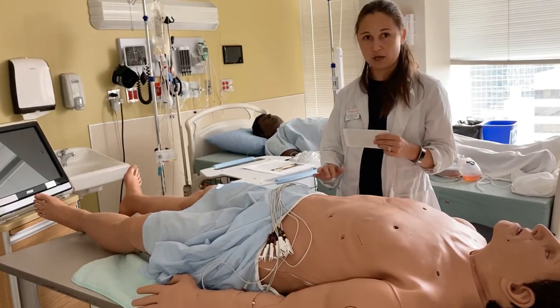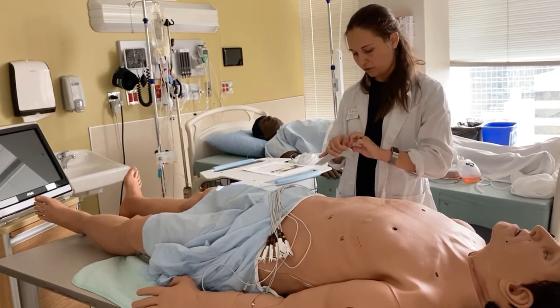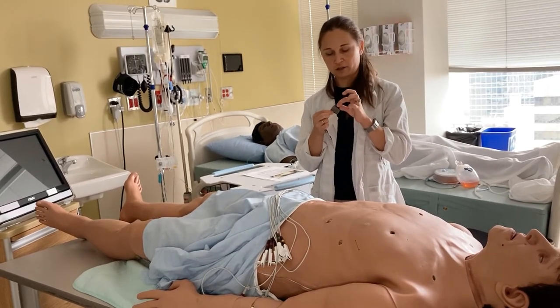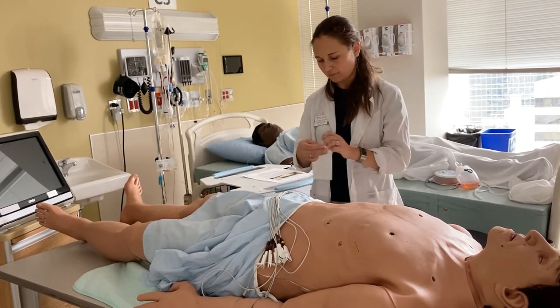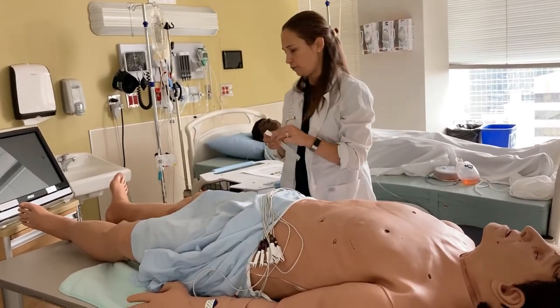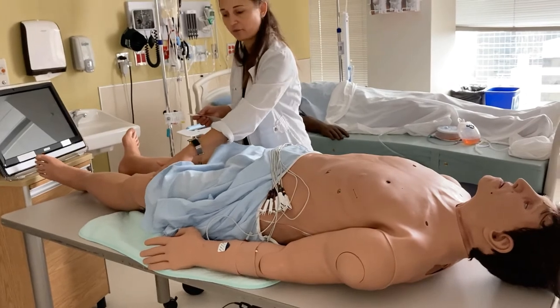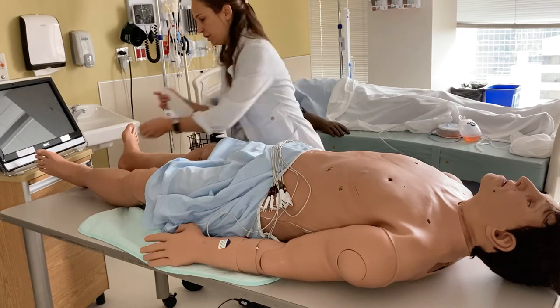For arm leads, we want to place electrodes with the little wing facing upwards, because you will be clipping your wire electrodes to these. We will place them on the muscle of the forearm on both sides. For the patient's legs, you have options: you might want to place your stickers either on the muscle of the patient's thigh or on the patient's ankle, again avoiding the bone.